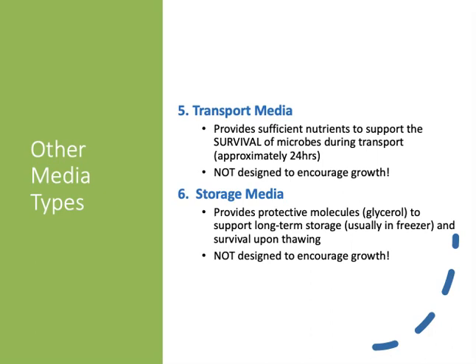Now, storage media is probably better referred to as freezer media because that's what it's used for. Storage media is used to keep a sample of microbial cells alive, but at very cold temperatures.